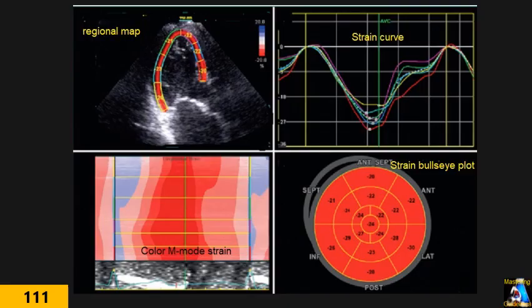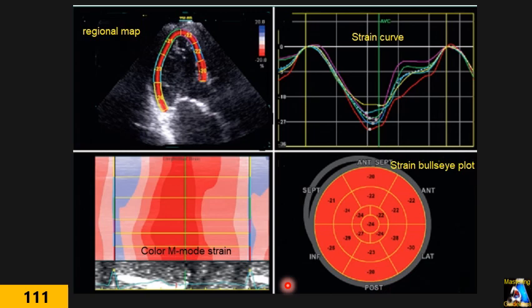Today, nearly everyone working with ultrasound machines uses speckle strain. In speckle tracking, the machine finds specific patterns — maybe 10, 20, or 50 speckle patterns in each segment — and follows them during cardiac activity. The software analyzes the results and displays them in three formats: a regional map, a strain curve (which includes longitudinal global, segmental, and strain rate), and a bull's eye plot based on segments. Another display is color M-mode strain, which shows results based on color and M-mode.